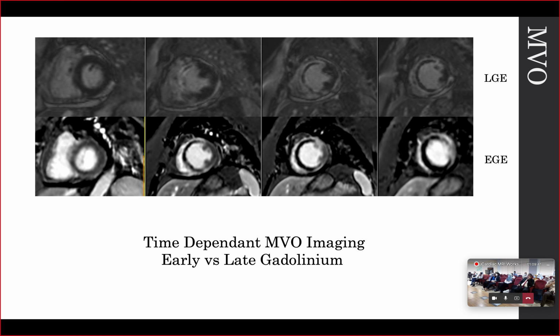Now research is discussing whether to measure the MVO in the early enhancement or the late enhancement, and which correlates more with the morbidity and the mortality. So far, it's the early enhancement that shows the real and accurate size of the MVO rather than the late MVO, as discussed in the literature.